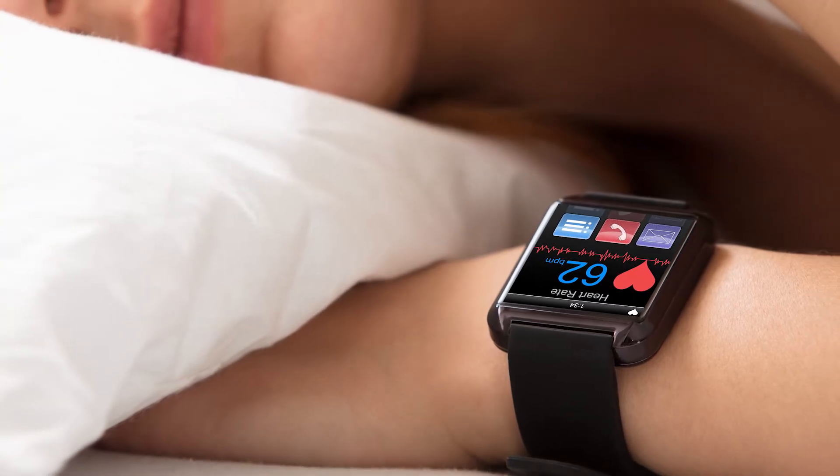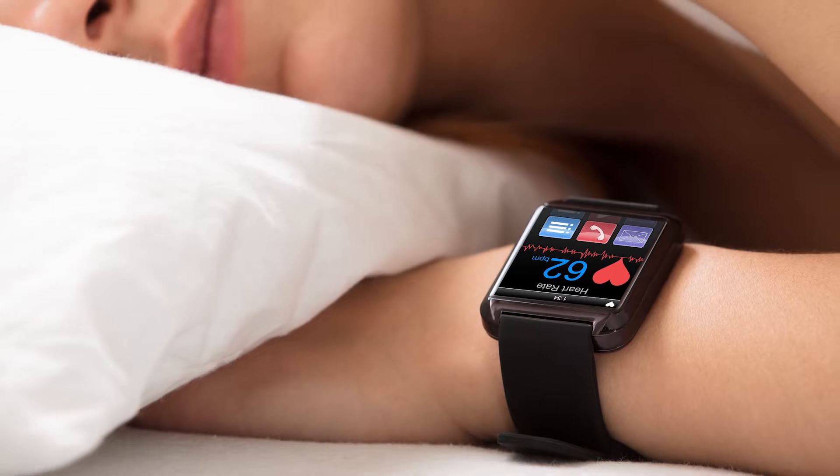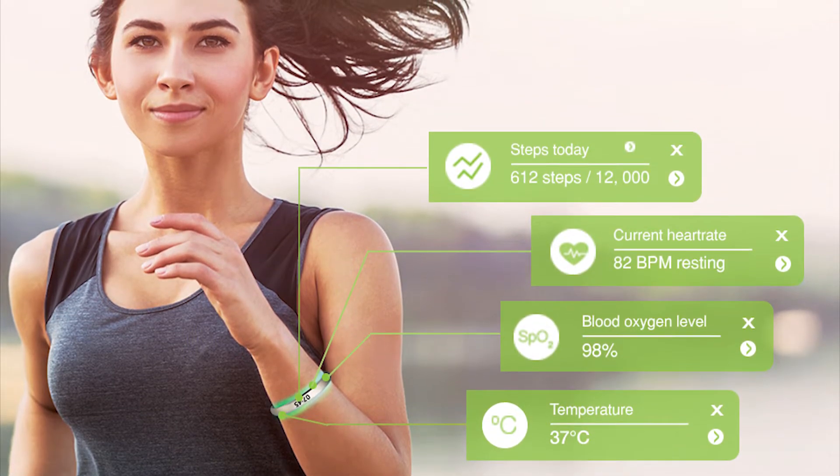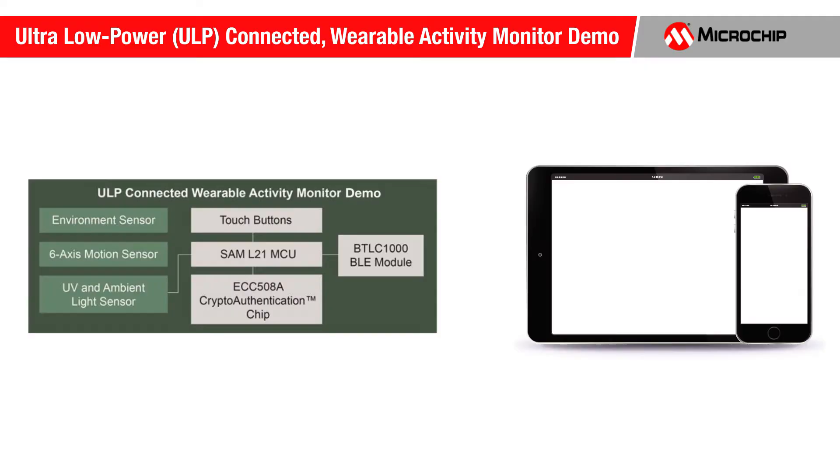These types of devices measure and analyze sleep quality, heart rate, body temperature, blood oxygen, and other functions. Bluetooth connectivity allows the demo to communicate with tablets, smartphones, or PCs with IoT capability.